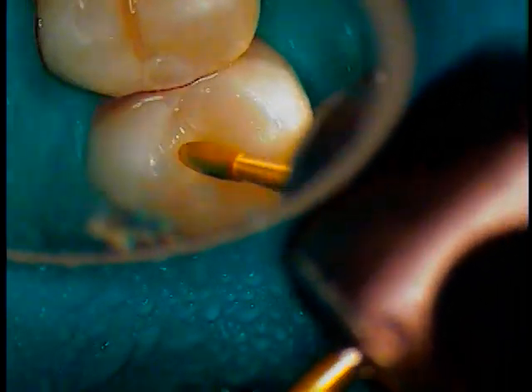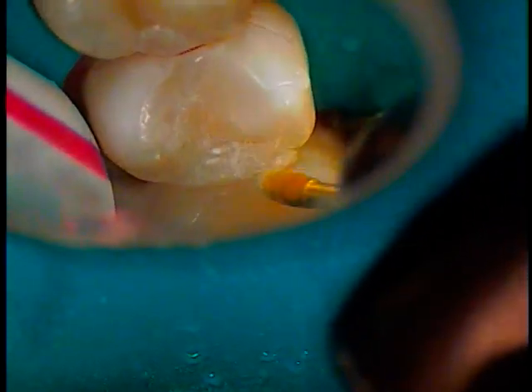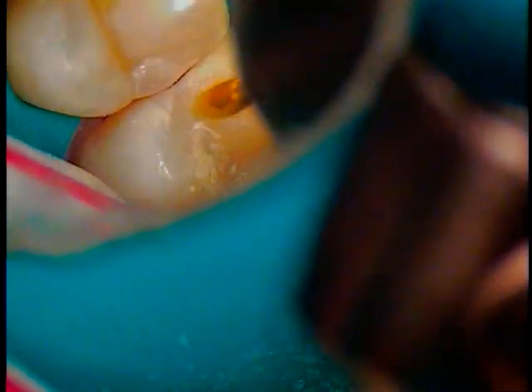All set for suction here. So this is a fluted burr, I think it might be a 20 fluted burr, but I'm staying basically on composite, not gouging anywhere, and just starting to finish it down. And nice anatomy.